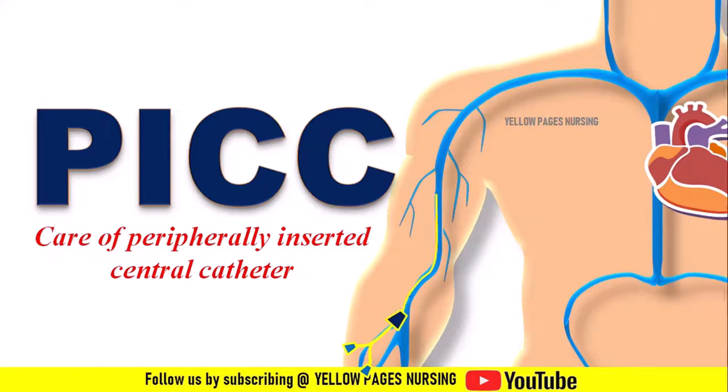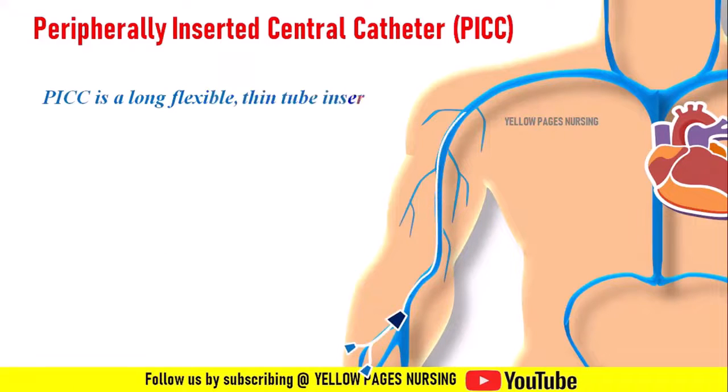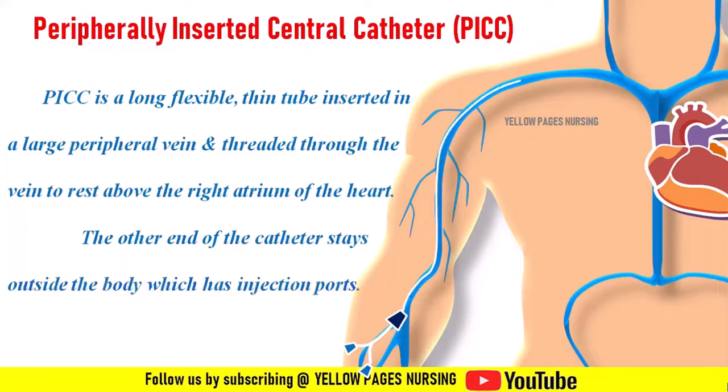What do we mean by peripherally inserted central catheter? A PICC line is a long, flexible, thin tube inserted in a large peripheral vein and threaded through the vein to rest above the right atrium of the heart. The other end of the catheter stays outside the body, which has injection ports.